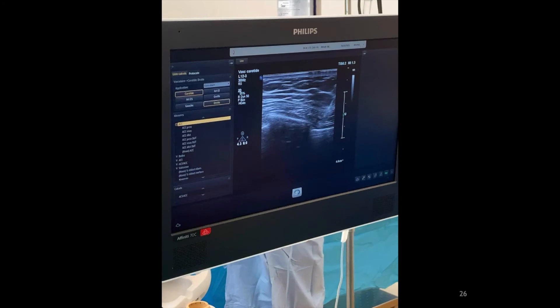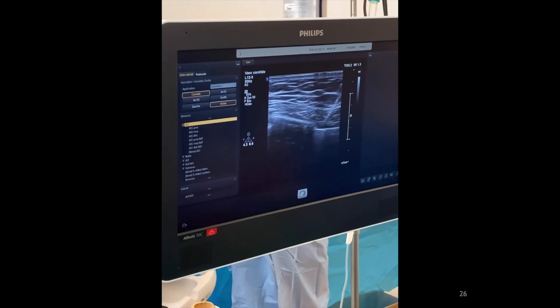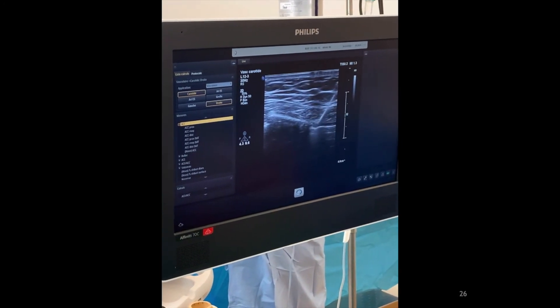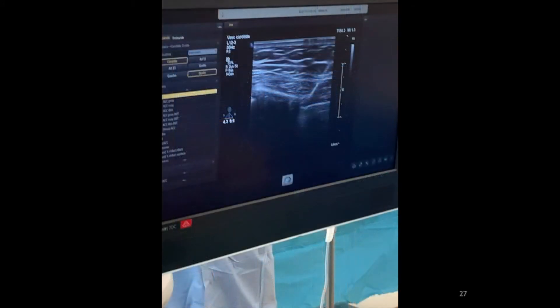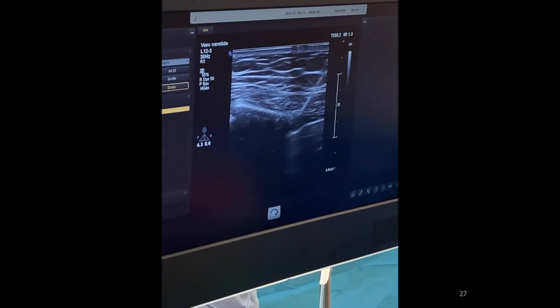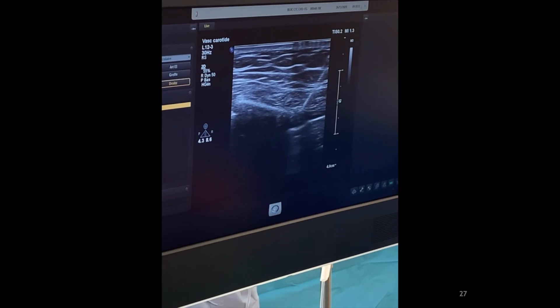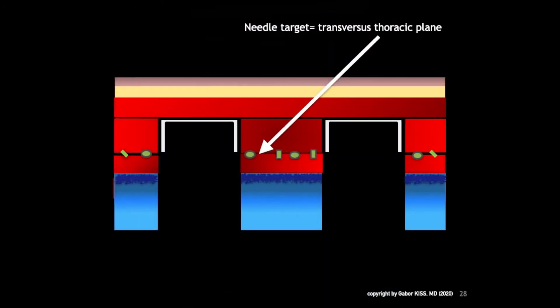During injection, there is a downward displacement of the thoracic plane, the transversus thoracic muscle and the pleura, which confirms correct deposition of local anesthetics into the transversus thoracic plane, also shown here on this cartoon.